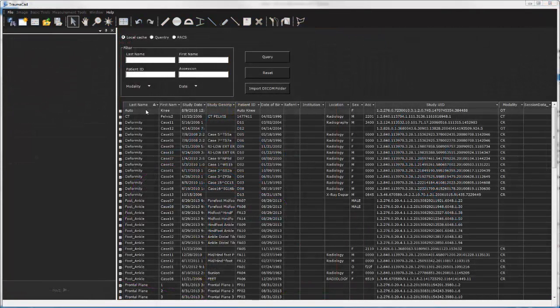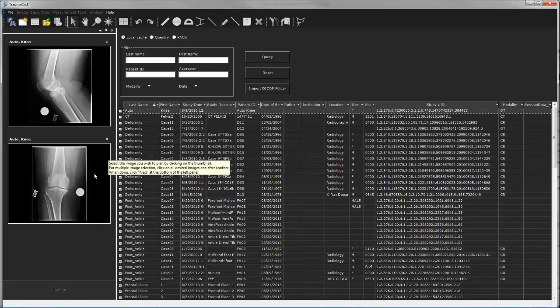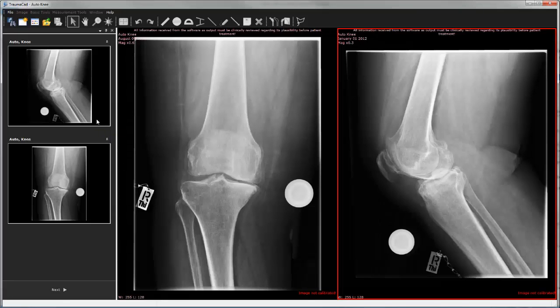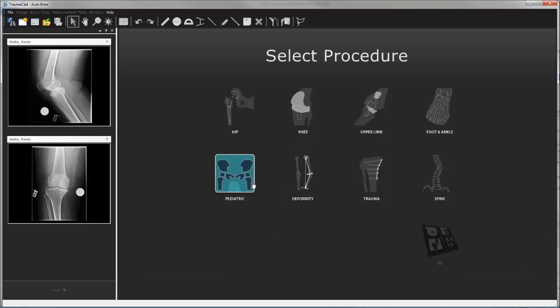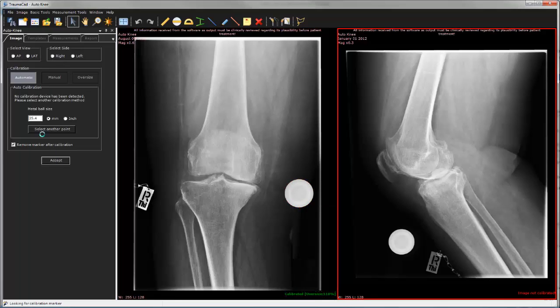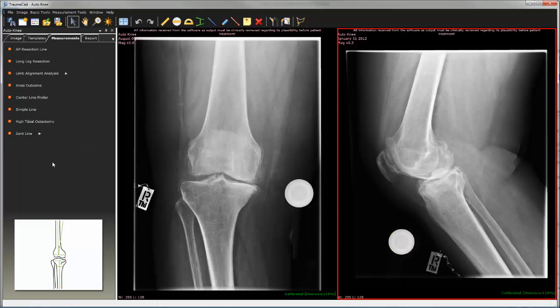To get started, select AP and lateral images from either the PACS, cloud services, or any other local storage. Select the surgical procedure and move on to calibrate the images using a known size marker or by oversizing. The ball marker is automatically detected by the application. Just click Accept and the images are processed.